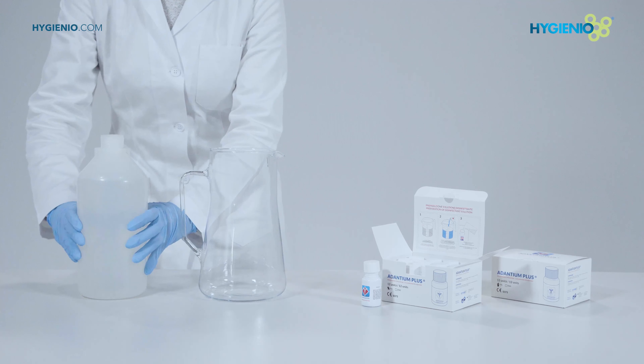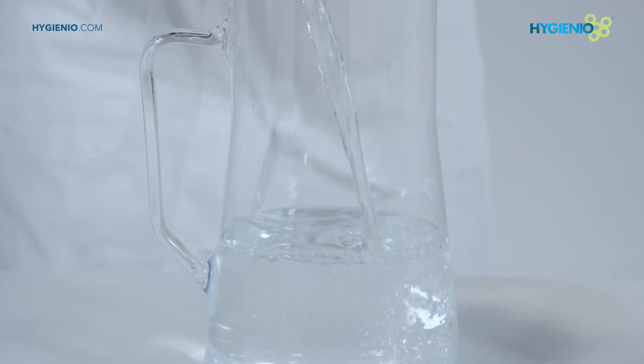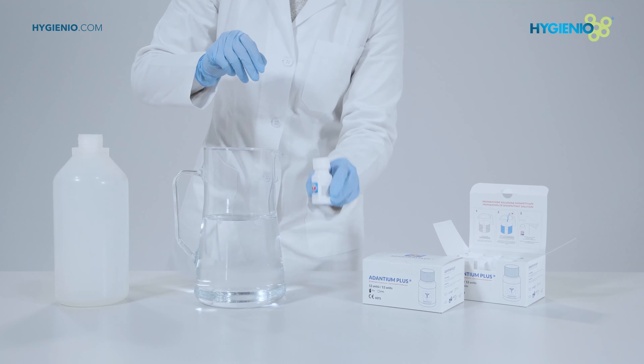Prepare the disinfectant solution in a container. Dilute Bedantium Plus into two liters of demineralized water.